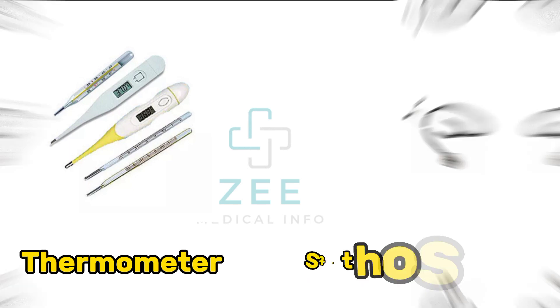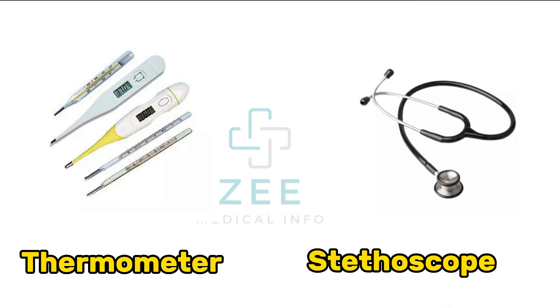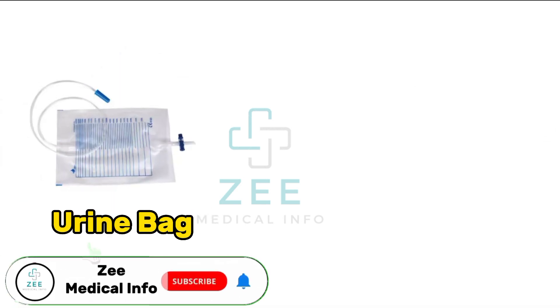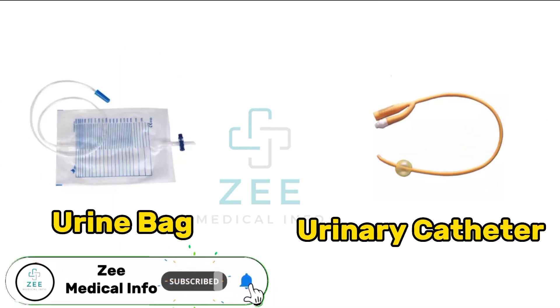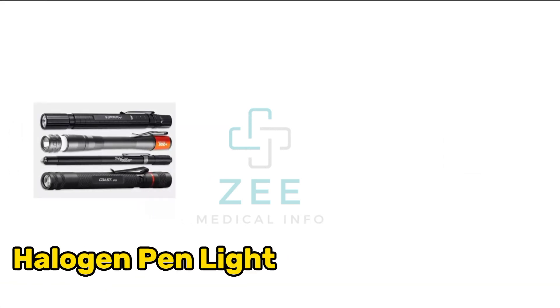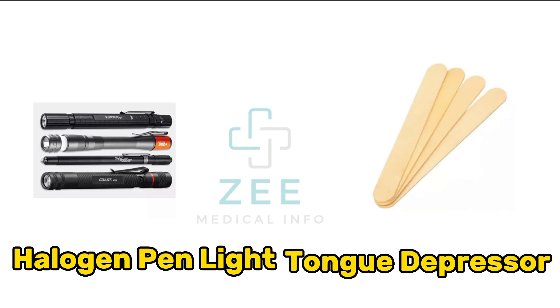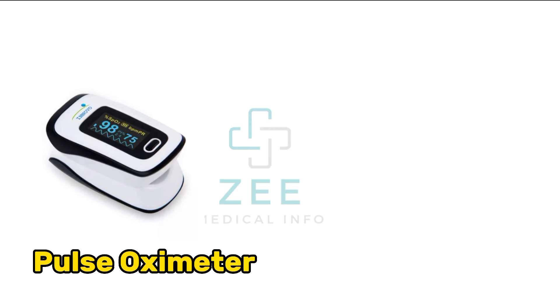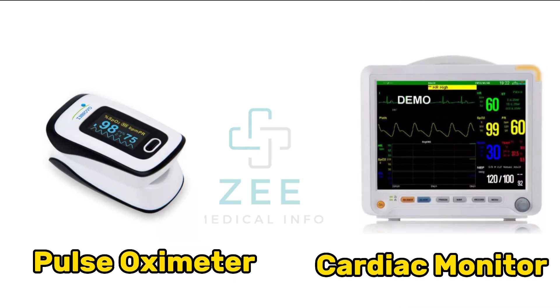Thermometer, stethoscope, urinary catheter, halogen pen light, tongue depressor, pulse oximeter, cardiac monitor.